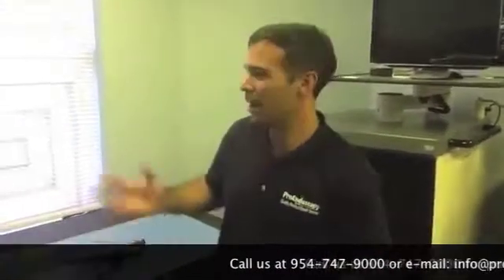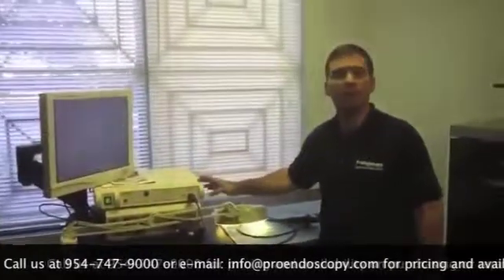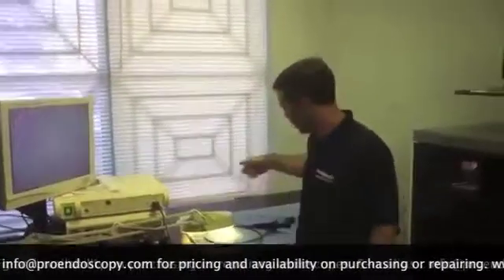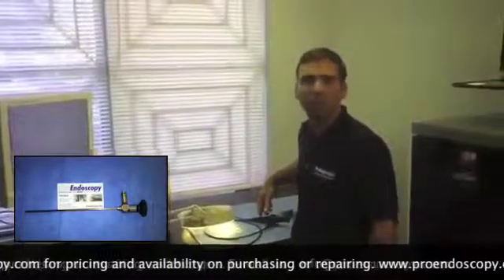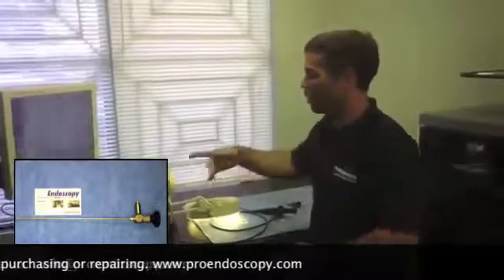Hi everyone, this is Cesar again with Pro Endoscopy. Today I'm going to explain — we had a purchase and an email come in regarding this camera. The purchase was with a flexible endoscope, and they wanted to know what settings to use on their camera.